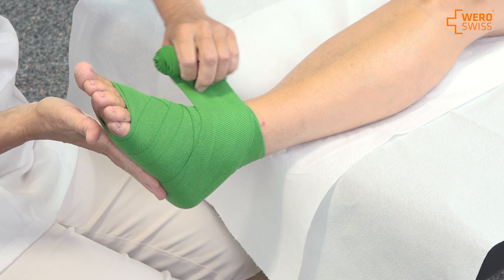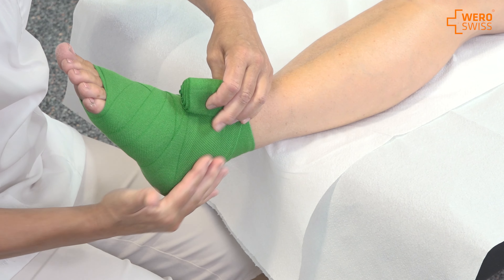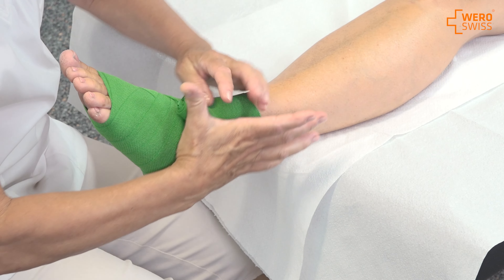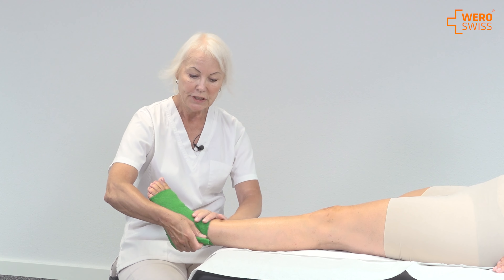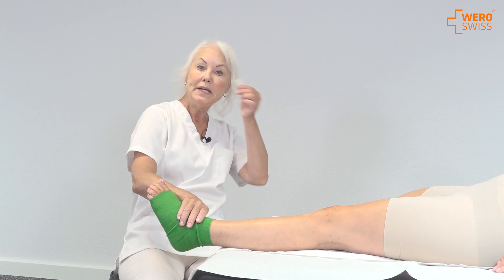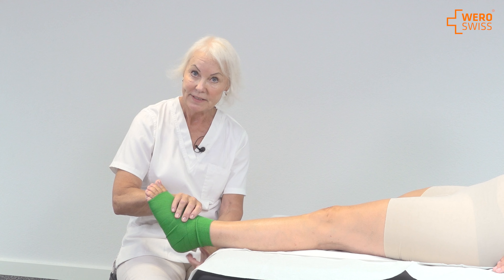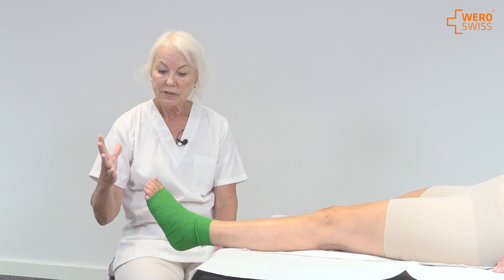At the bottom area, I do the second one to make it firm on the upper part of the heel area. Then I do one more of the figure-eight and end the bandaging with circles. I have my already-made tape to fasten and end the bandaging for the patient.